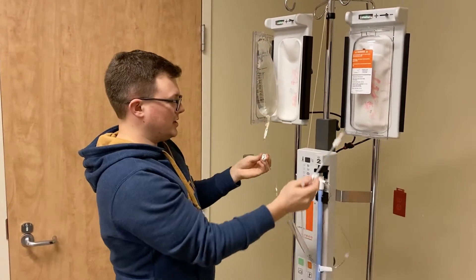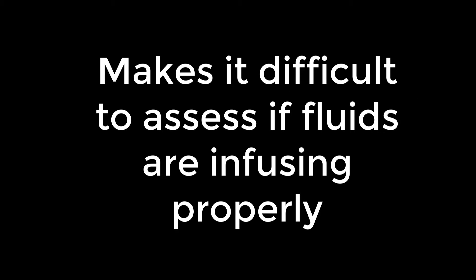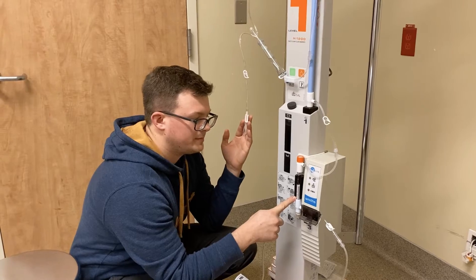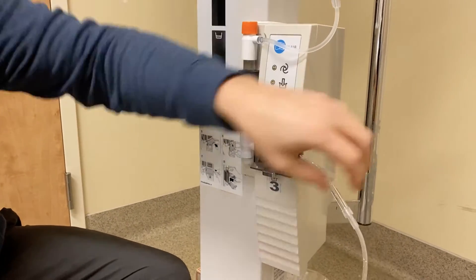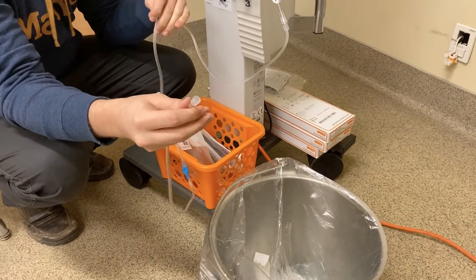Now you're basically ready to prime. Make sure this side is still clamped, then unclamp here and squeeze your drip chamber a couple of times — you want to fill it about halfway. Go to your next clamp; it should be dripping through. You're going to see your air chamber fill up. Open up your next clamp, then open up your roller, and you're basically primed at this point.